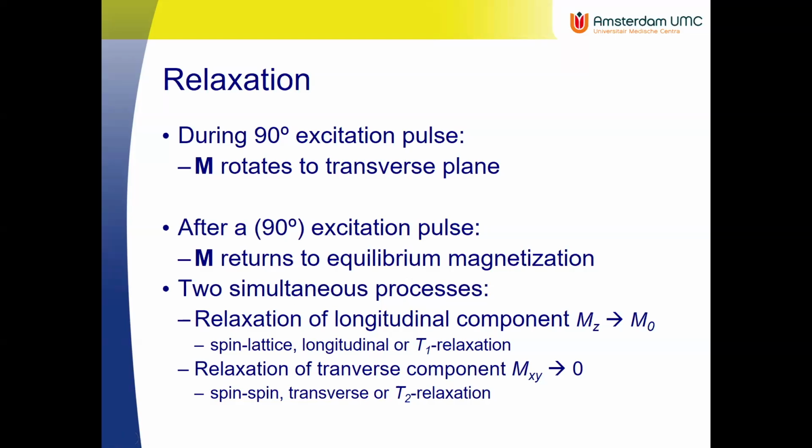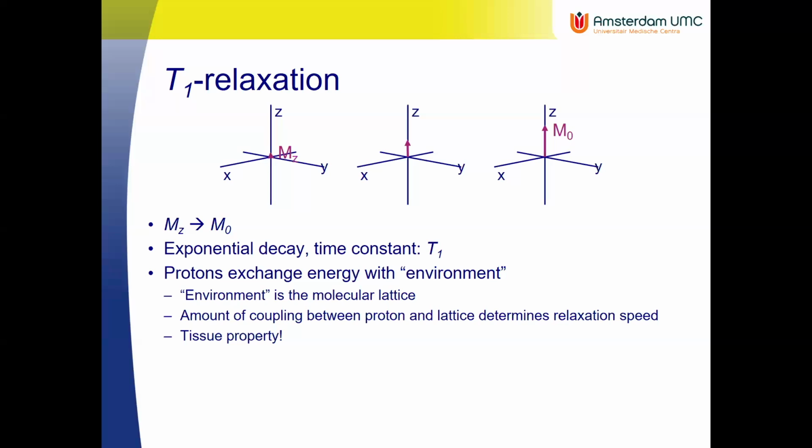Those names listed here are actually different names for exactly the same process. They mean exactly the same, so you could also use them interchangeably. Okay, so there we go. We're going to look at those two processes in detail now, and the most difficult one we take first: the T1 relaxation. If we get that, the other stuff will be easy peasy.